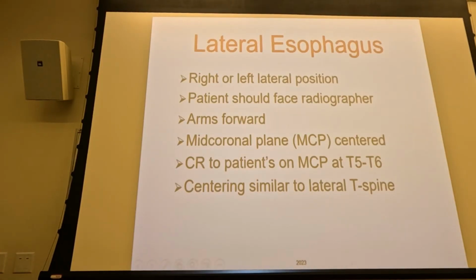So lateral esophagus, nothing really new here except for the patient to be in a lateral position, lateral projection. Mid-coronal plane is going to be perpendicular to the image receptor, parallel to the central ray. Arms out in front of the patient.